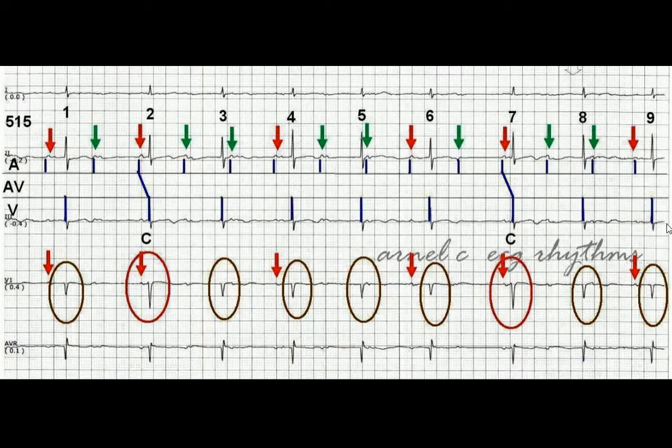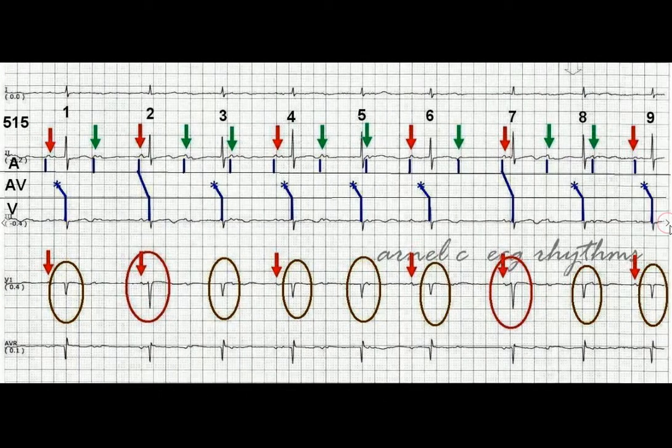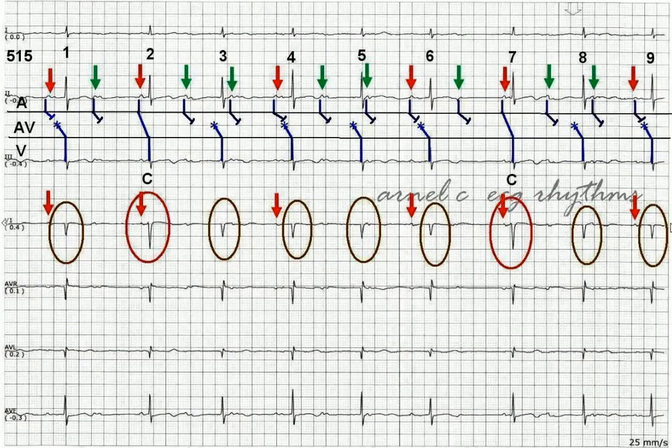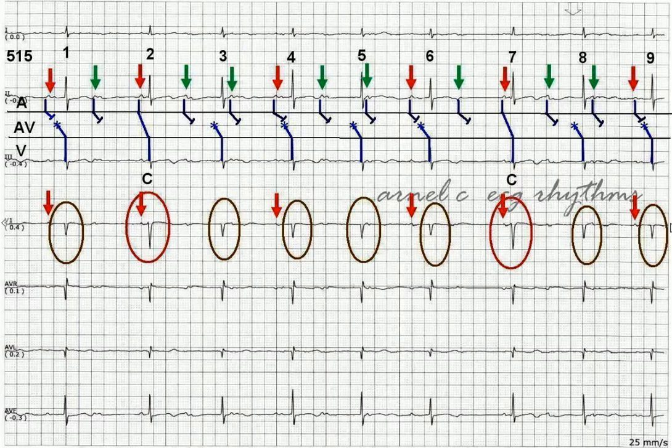Now, let's connect the A tier. QRS 2 and QRS 7 are captured beats, or sinus beats that were able to conduct through the AV node. QRS 1, 3, 4, 5, 6, 8, and 9 are from the junction. Now, here is the completed ladder diagram. The rest of the P waves are not conducted.